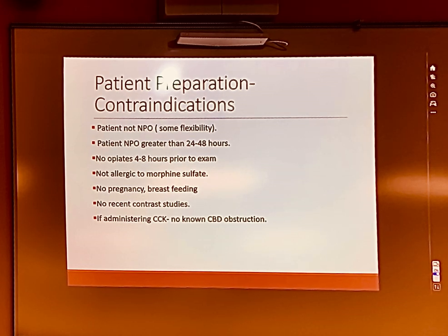So it depends on what school of doctor you are, whether you're going to give CCK to patients that have stones or that don't have stones, and it's up to the radiologist. I will tell you, if you do give CCK to a patient that has stones, they will be hurting kids, so just be prepared for that.